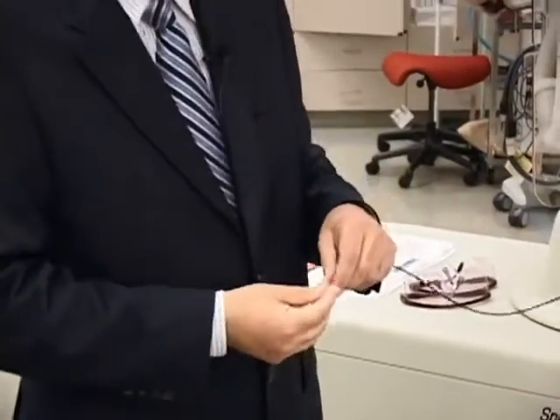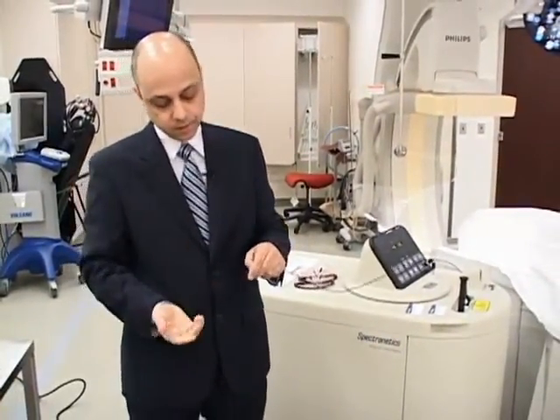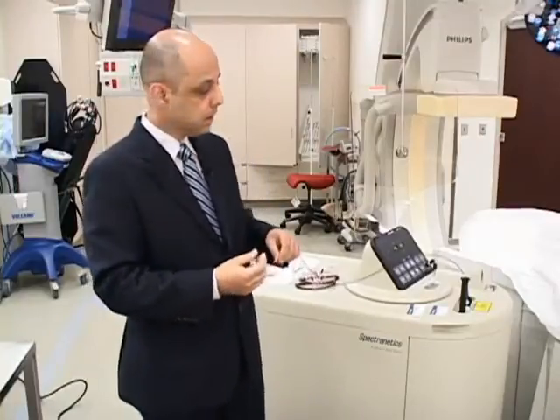This has made lead removal — or lead extraction, or laser lead extraction as some people call it — much safer. Despite being very safe nowadays, laser lead extraction requires equipment, requires cardiothoracic surgery, requires anesthesiologists, and requires a trained team to be able to safely remove these leads.